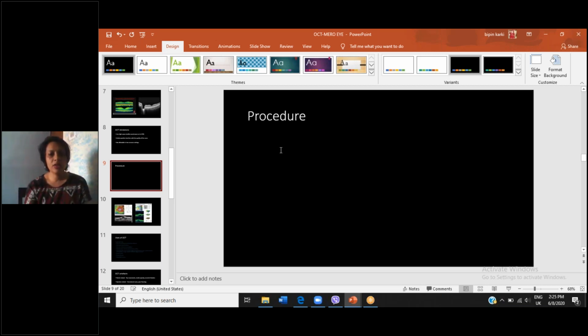So when you do the OCT, this is the kind of result that you get. This one is the thickness map, where the thickness is given here in another picture, and the numbers on the ETDRS division of the retina. Red always means it's swollen, angry, and pathological. The green and yellow colors are more or less the normal retina. If you see blue somewhere, that's thinning of the retina. So this is just a color-coded map. And you see the cross section. This is how you get the retina.